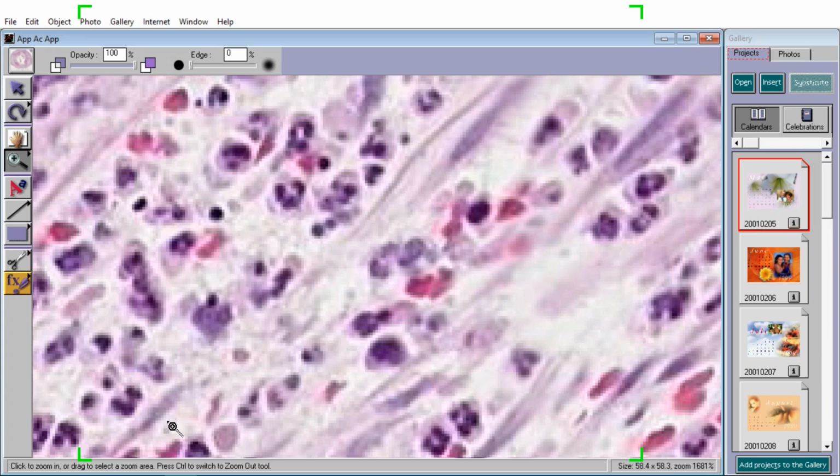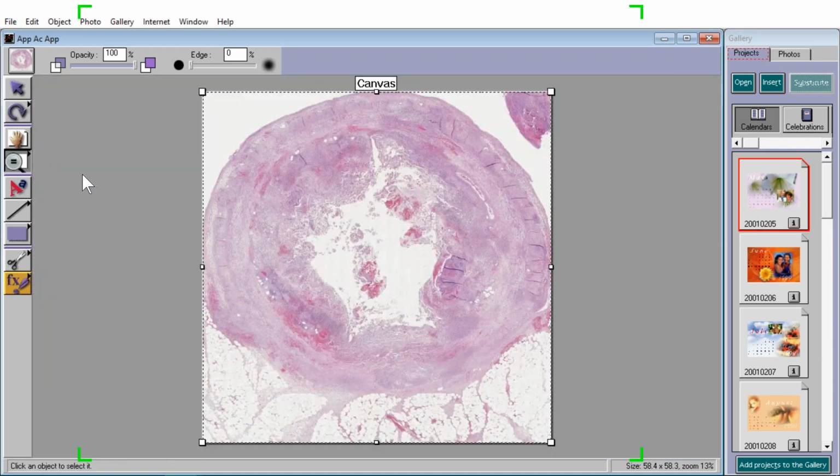Yeah, somebody already got the diagnosis. This is your classical acute appendicitis. This is what the pathologists see every time a surgeon removes an appendix. And thank you for answering. I appreciate that very much. Let's see if I could say anything else.